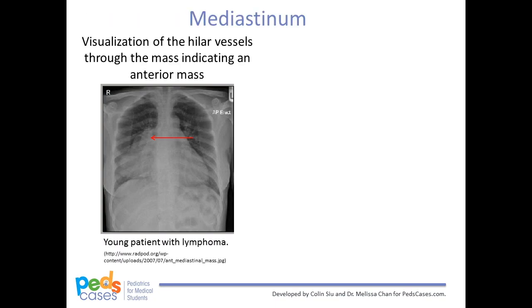In this section, we will go over the identification of masses in the mediastinum. First, we need to ascertain that the mass is indeed intra-mediastinal. Intra-mediastinal masses do not contain air bronchograms and have obtuse margins with the lungs, whereas a lung lesion will create acute angles with the lung. The mediastinum is divided into anterior, middle, and posterior sections. The middle section is comprised of the great vessels, trachea, and esophagus. Posterior deviation of the trachea, obliterated costophrenic angles, effacement of the ascending aorta, and visualization of the hilar vessels through the mass — as in our patient — are indicative of an anterior mediastinal mass.